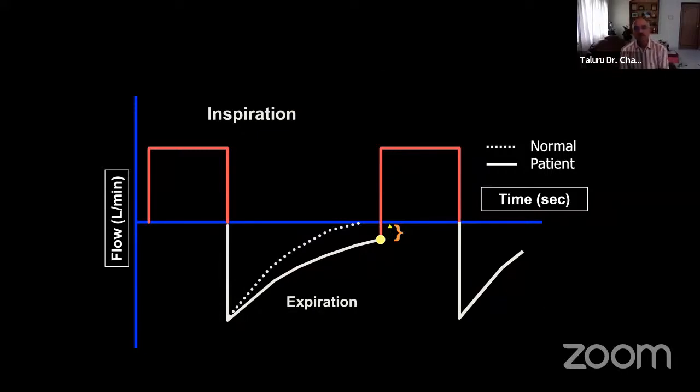No, I would say that the expiratory time is prolonged. TE is prolonged, one. And there is no total emptying of air, as somebody has typed, air trapping. Some air is remaining. It's not touching the baseline. This much air is remaining. If it happens from here, probably then the air trapping is more. This is what you can appreciate by looking at this wave.